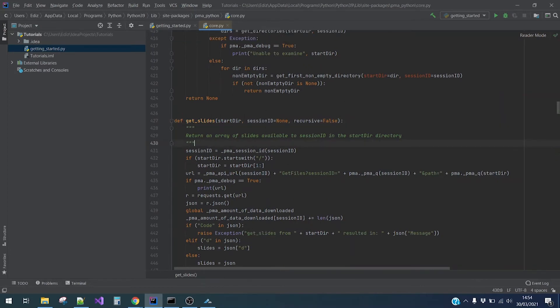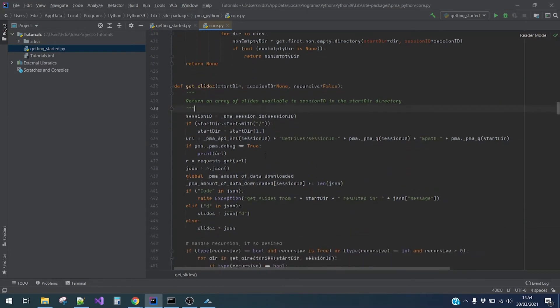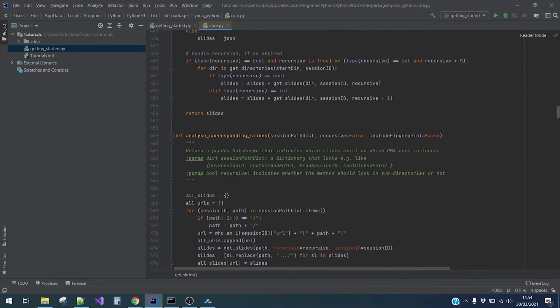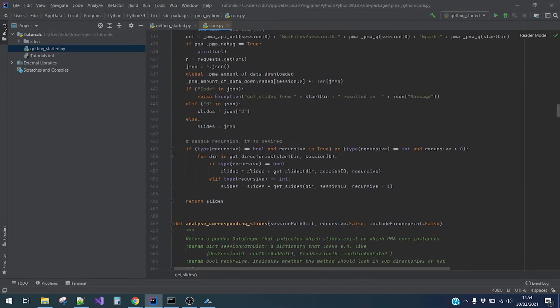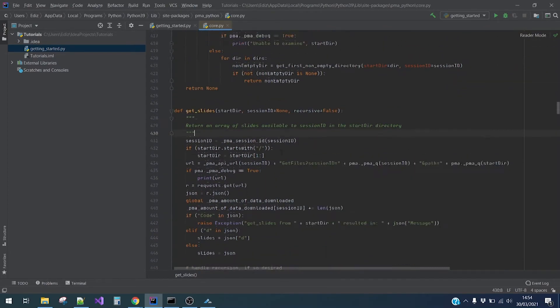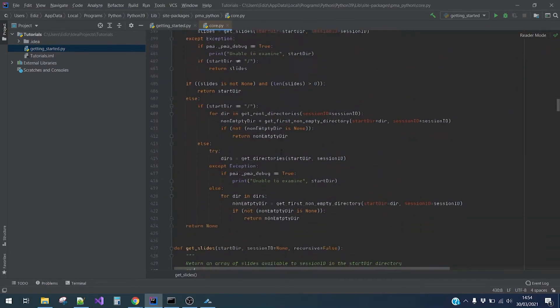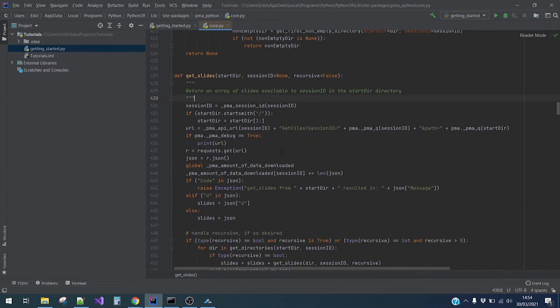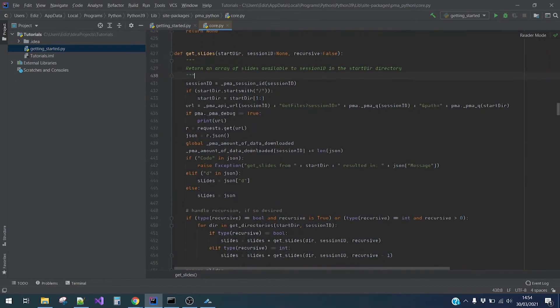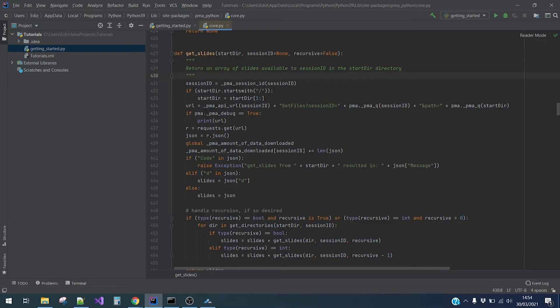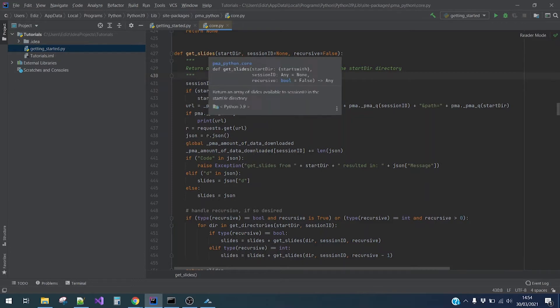As a first example, we will pick getSlides. So we can read here that this method returns an array of slides available in the start directory and we are only required to fill in the directory parameter. Let's try it out.